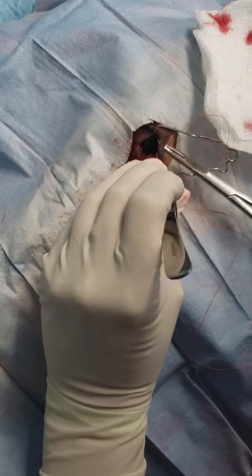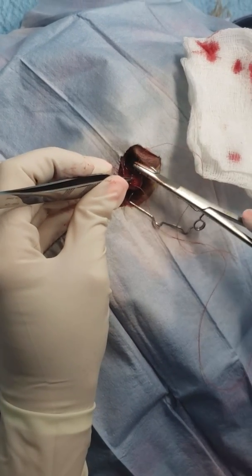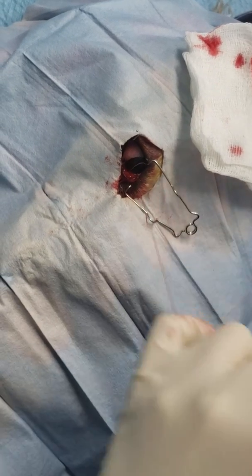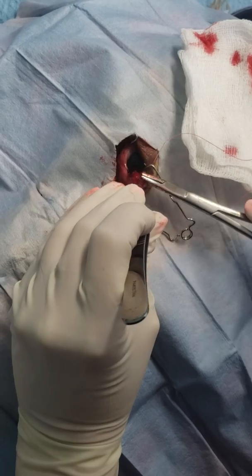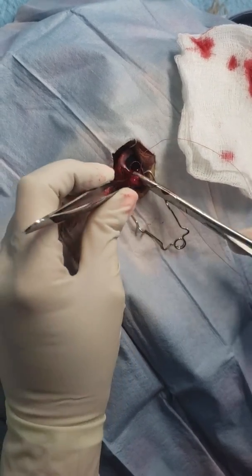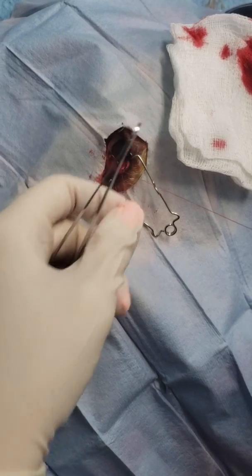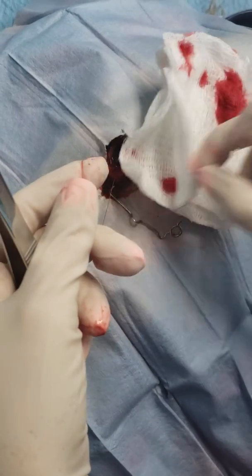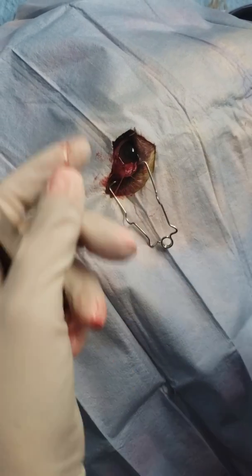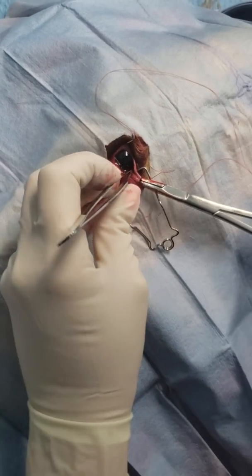You also want to plan ahead for when you're going to bury your knot at the end. When you bury your knot at the end, you need to remember that all pieces of it need to be deep, otherwise you're not going to get a buried knot.